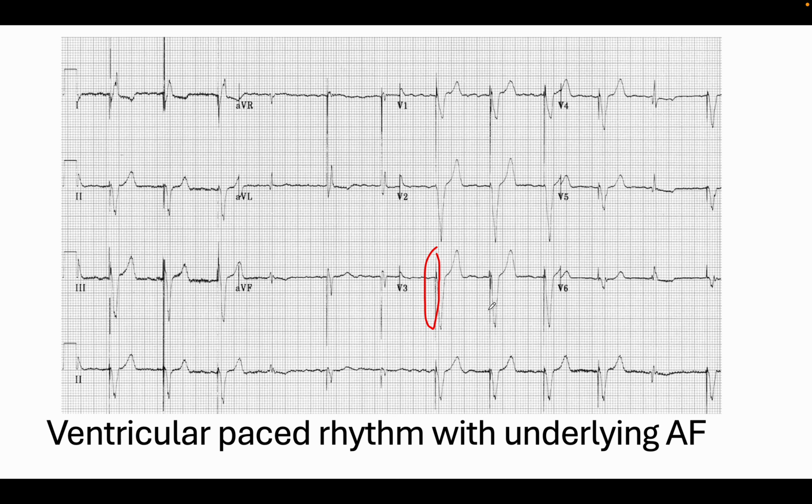One thing to know is that patients with AF usually don't have a right atrial lead, because you can't track AF. You can't track AF because it's too fast. So we usually only put single chamber devices in for these patients.